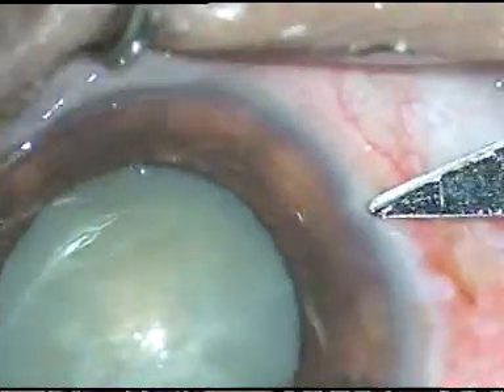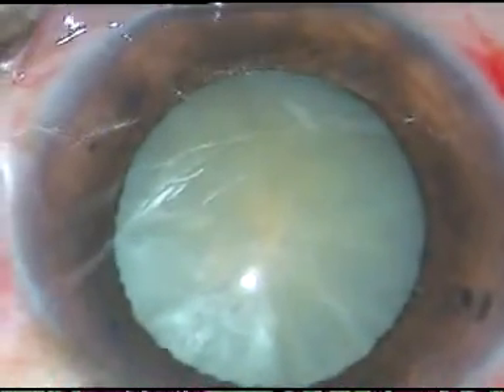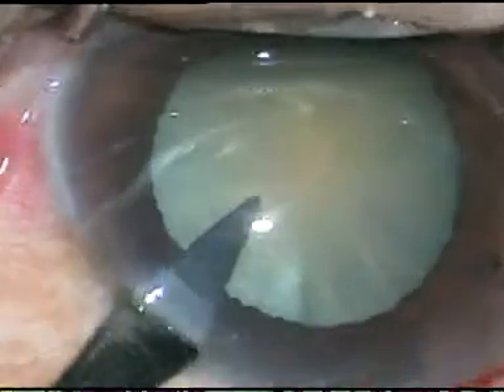The main incision has been made. This is a side port on the right side of the main incision. And now this is another side port on the left side of the main incision.